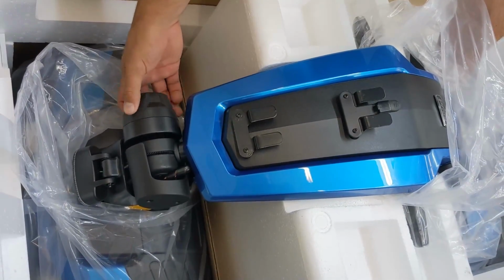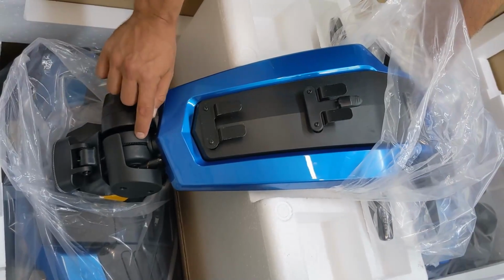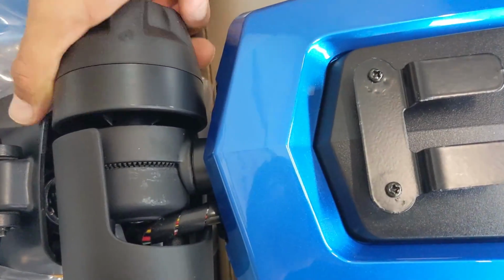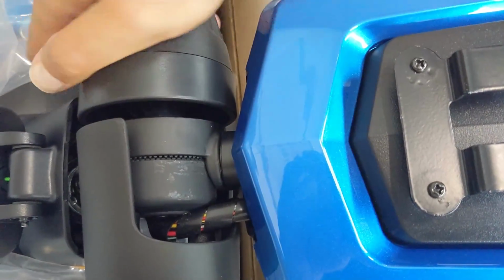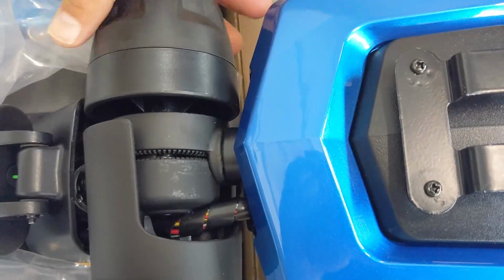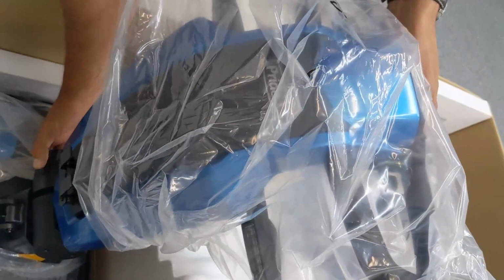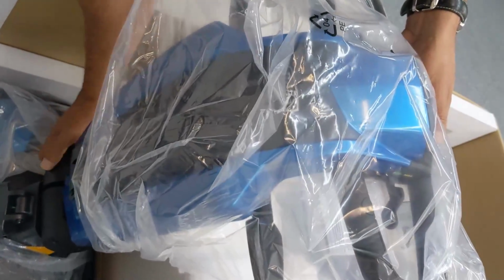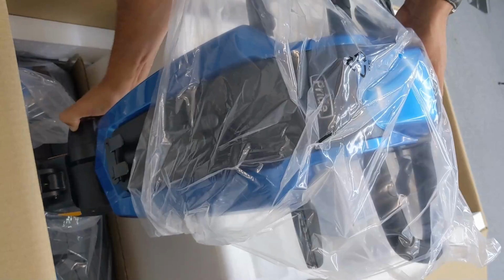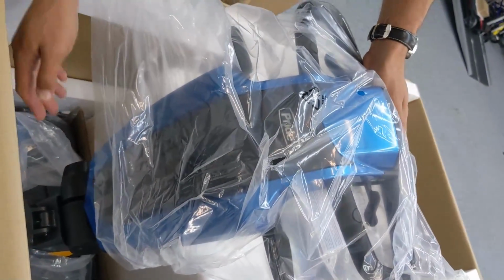Some have a lever, some have a knob. So as you loosen it, you can see the little teeth there on the rotating mechanism get closer together, and then once it's tight enough, it gets locked into place. Now if you loosen it all the way, those teeth kind of open up, and we can bring the handlebar all the way up, which is what we want to do when we're getting ready to take this scooter out of the box for the first time. So I've simply raised the handlebars on the tiller, and tightened that knob.